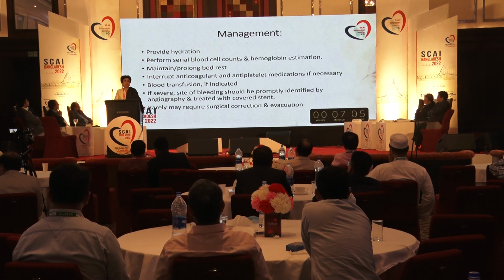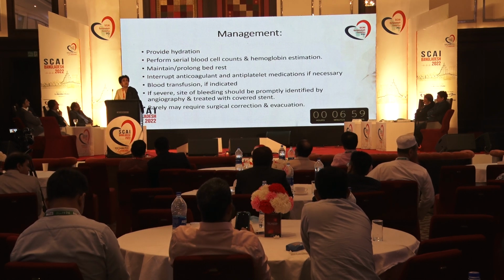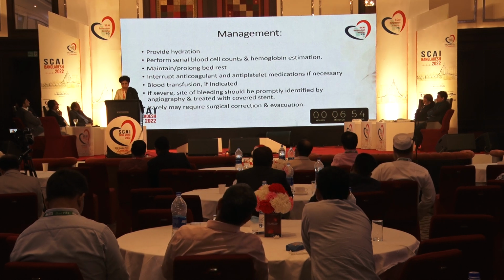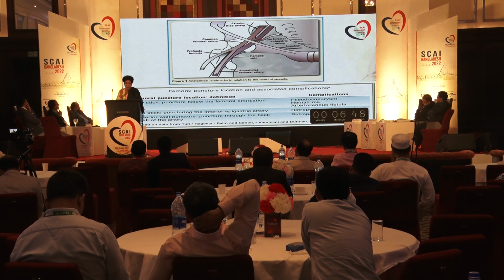But for large bleeds, you need to have the covered stent on your shelf so that you can apply it immediately. And very, very rarely, we have never ever done it in our experience, will you require surgical correction or evacuation. So with that, we also need to know where to puncture.